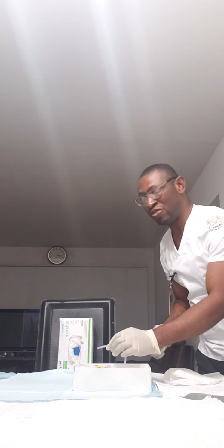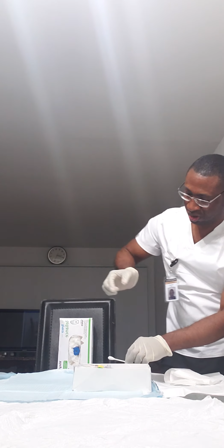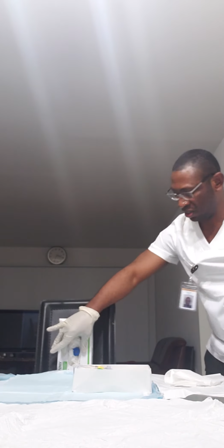Yes, I have to lubricate. If it is a male patient, I lubricate 5 to 7 inches. If it is a female patient, I lubricate 1 to 2 inches. Okay. All right. So grab this with my 2 hands. One side up, down, go around, trash it. One side up, down, go around, trash it. Once at the middle, up, down, go around, trash it.